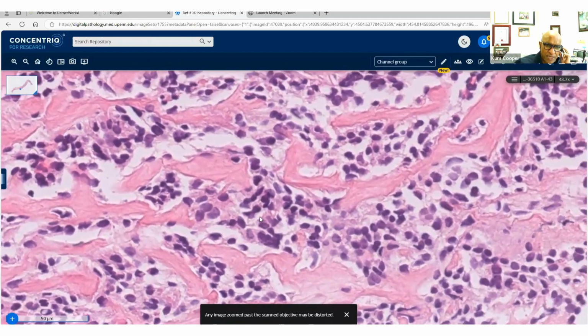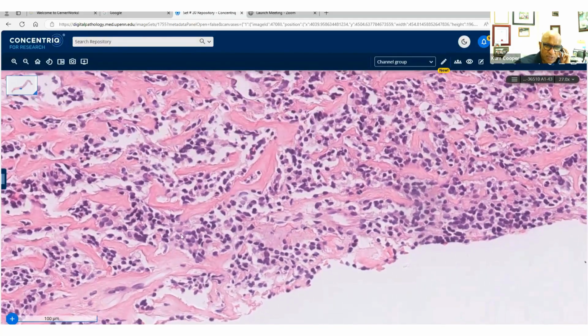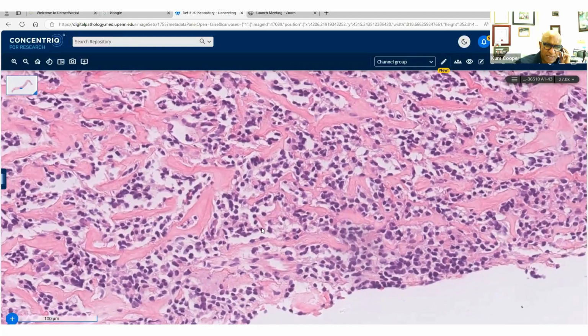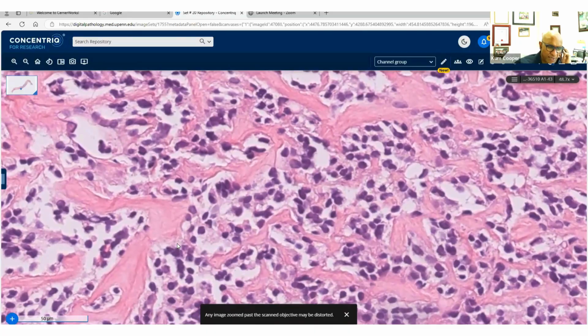In this case, the actin was positive, diffuse, but the desmin and the caldesmon were negative. So actin was positive. I'll submit that to the discussion and conversation.